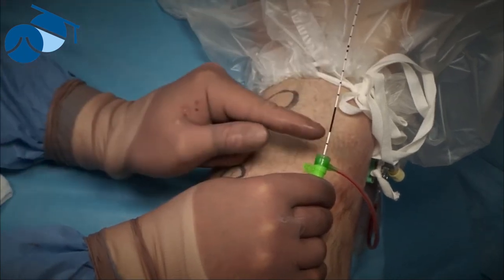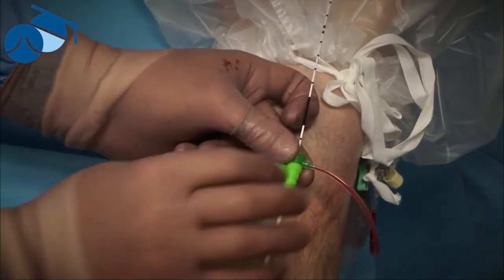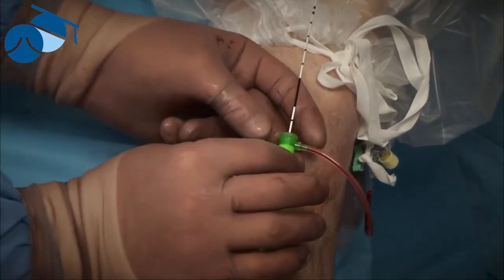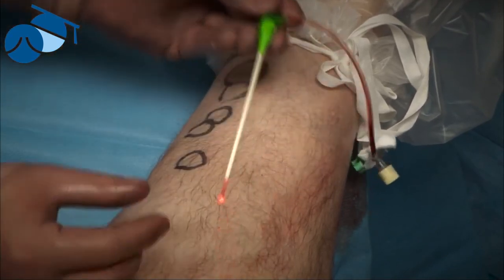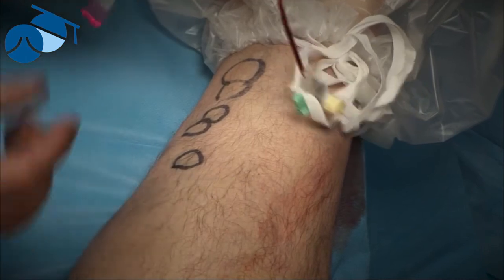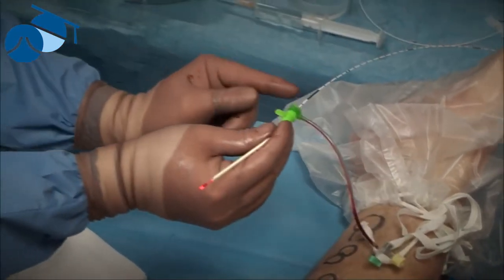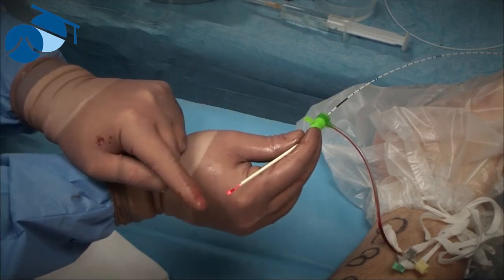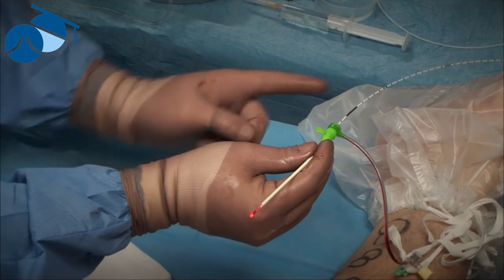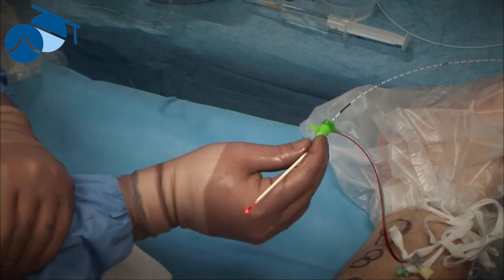So we can see with 2 centimetres on for the black, the whole time I've been holding this cannula absolutely still with my right hand, as that's my measuring device. If I pull this out now from the skin, we can see that where the end is, it's about 1.5 centimetres on. So I know my system here, with the way I use it. 2 centimetres there gives me the right depth that I want on this side. Whichever system you use, as long as you know the relationship of this mark to this, you'll never burn the skin or have a problem.